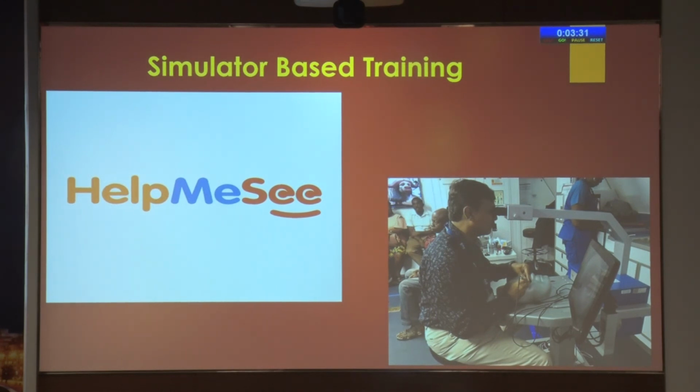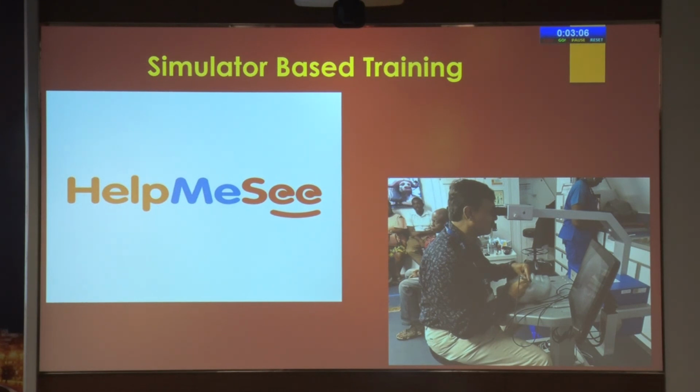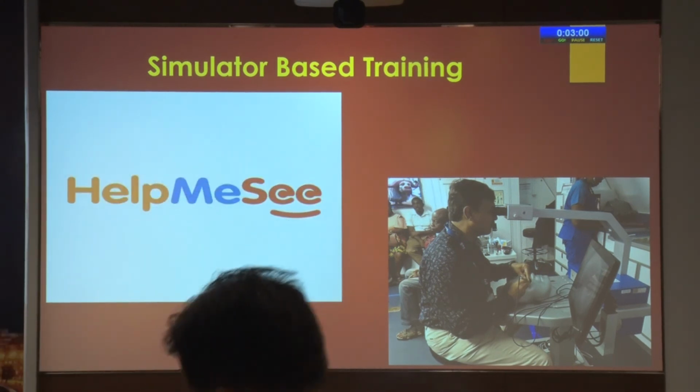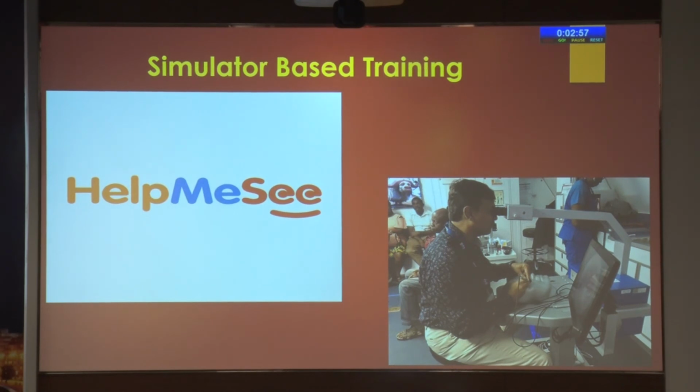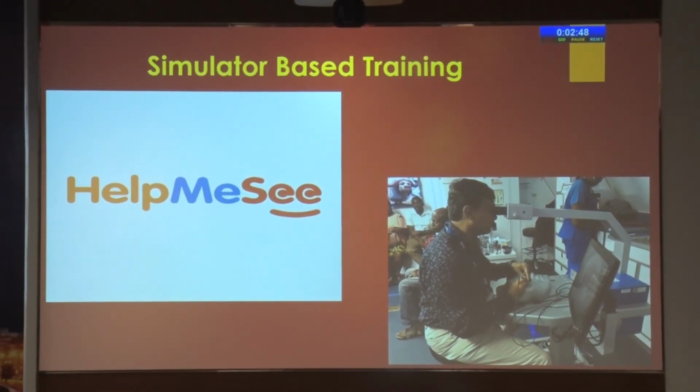Another important advantage for newcomers is simulator-based training. There is a stall by Help Me See. They have come out with simulation-based training for manual small incision cataract surgery. Initially, there used to be only a few steps of simulation training. Now they have come out with complications of MSICS also, and now they are coming with simulation for phacoemulsification also. In fact, a study was conducted with Help Me See and LV Prasad Eye Hospital. The students were exposed to simulator training, and then to surgery, and their skill was far better than those students who were not previously exposed to simulation training.